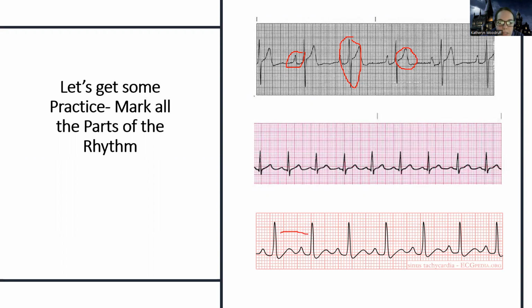Here's a good one to show R to R. So you see there's the same distance here as there is here. So you can practice this yourself too, if you'd like. These are on your fill in the blank notes too. So if you want to do it on your own paper and print it out, I find it helpful. So there's the same distance. So in other words, this would be the R to R.